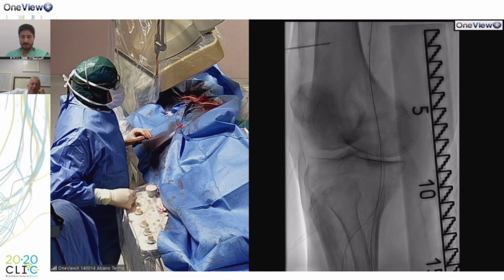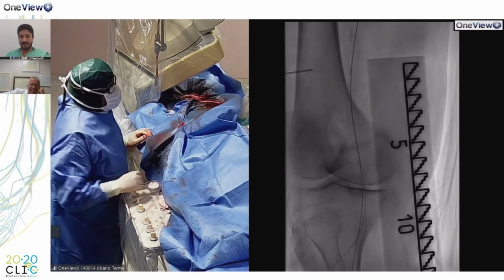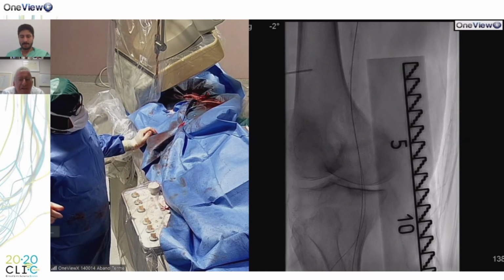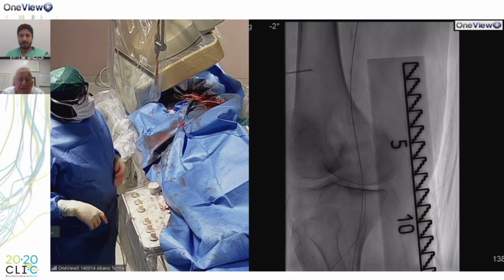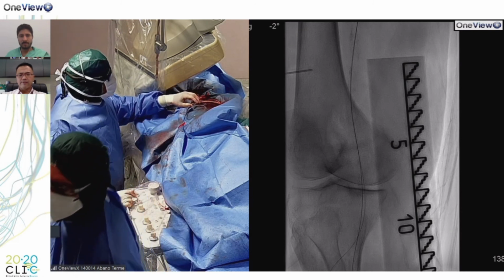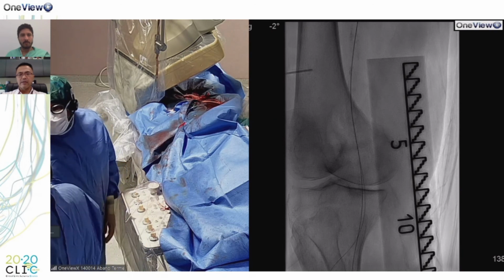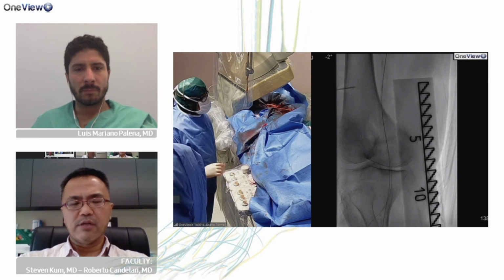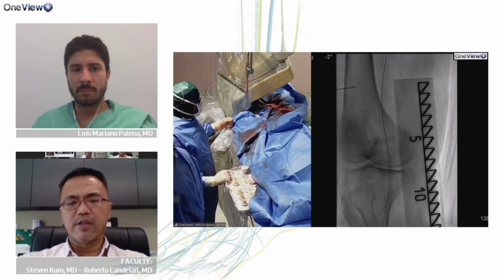You should use IVUS imaging. Yes, we did, and they collect the size. Perfect. Actually, Roberto, I think based on the IVUS that Marco did, the P2, P3 was about 5 millimeters in diameter, just by visual estimation. So perhaps the 6 millimeter stent would be reasonable, at least in the distal popliteal.